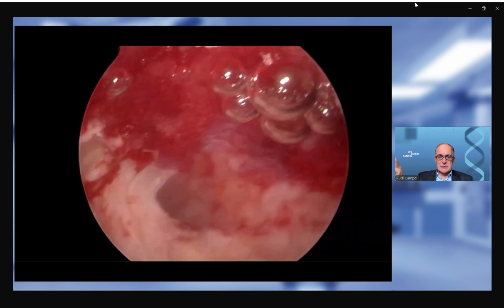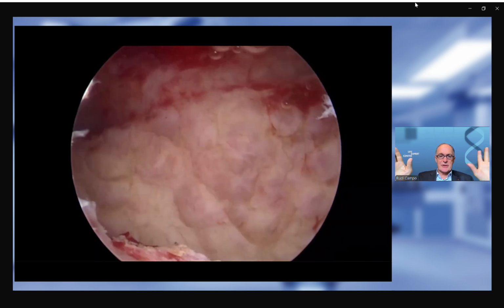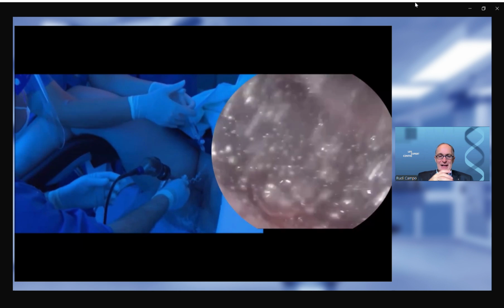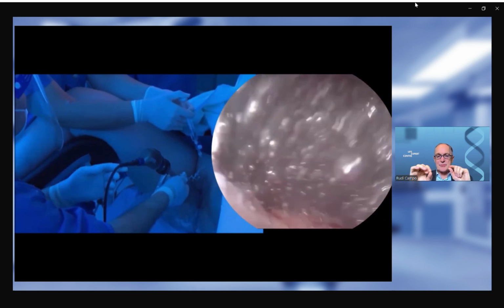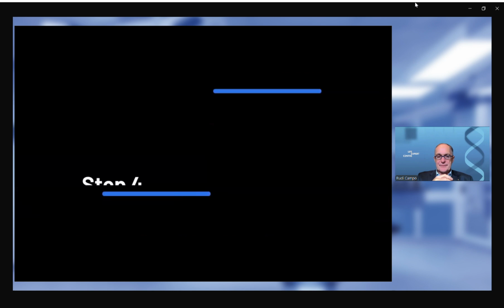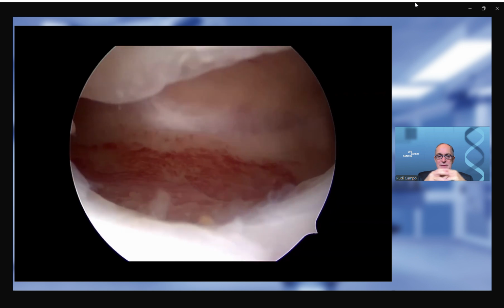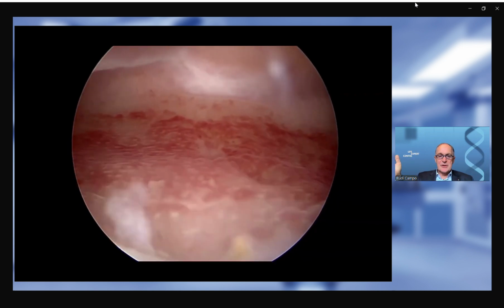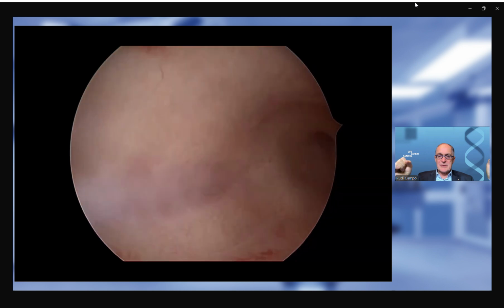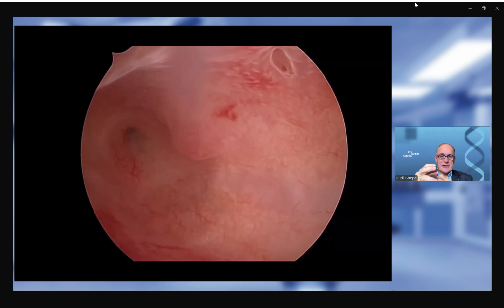Oh my God. 8 weeks later, and they don't get estrogens, they are under GnRH analogs. We put the gel, sorry. And the gel we put always with the hysteroscope and through the outer sheet, and we do the ultrasound concomitant. After 8 weeks, I cannot believe it, no adhesions. This is the same patient. Tubal ostia, your anatomical landmark. You go to the other side, little polyp.